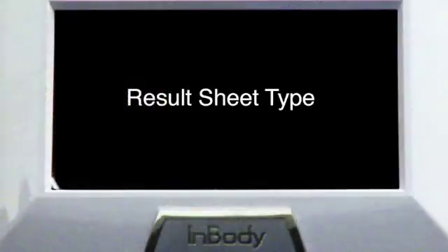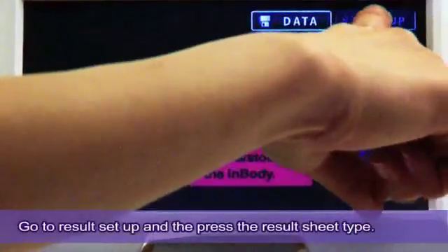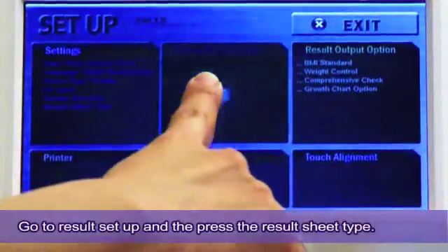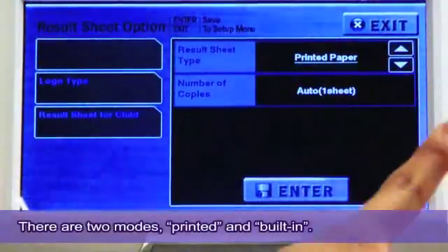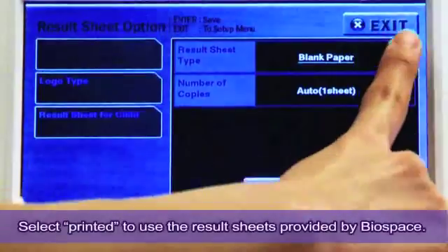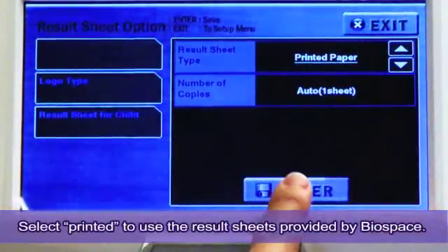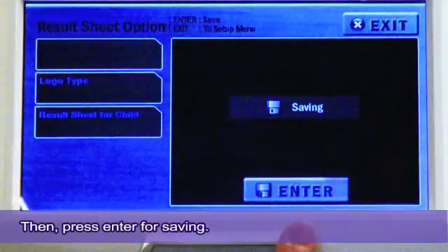Result Sheet Type. To modify the result sheet type, go to Setup and then press the result sheet type in Result Sheet option. There are two modes: Printed and Built-in. Select Printed to use the result sheets provided by Biospace. Then press Enter for saving.